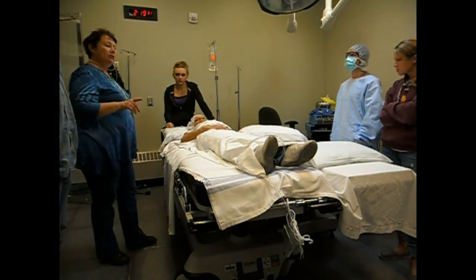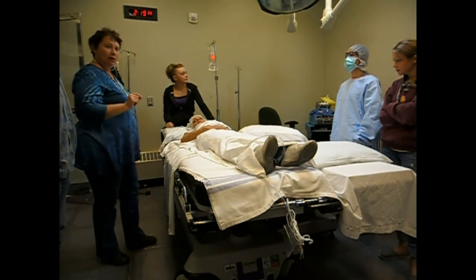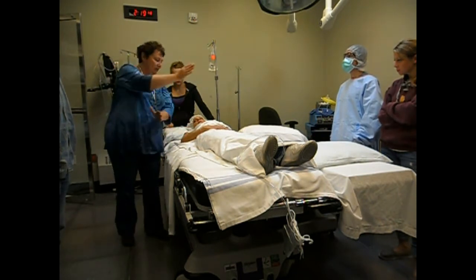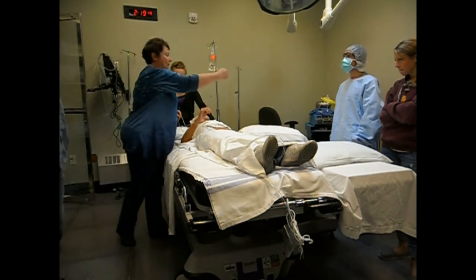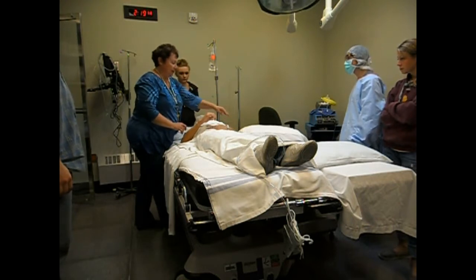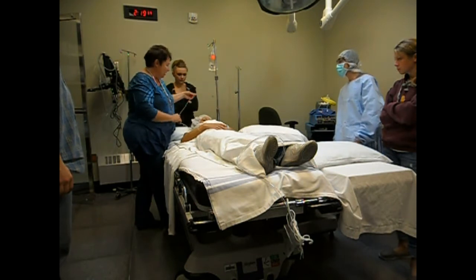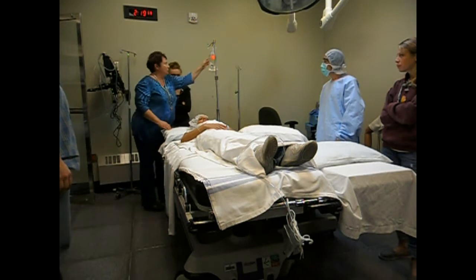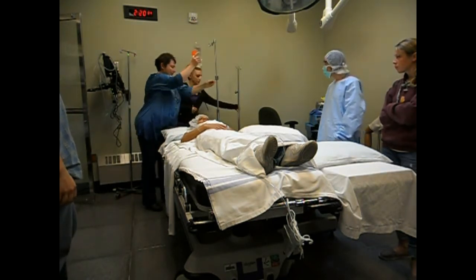And so now what we want to do is figure out where we want our IV and where we want our Foley catheter. You have to take into consideration that she's going to be moving this way and her IV is in her right arm, so it's going to end up on that side. What I don't want to do is put the IV across my patient's chest because she's going to end up laying on it. So I'm going to want this like this, and then we want to put this on an IV pole. So Randy, I'll have you put it in.